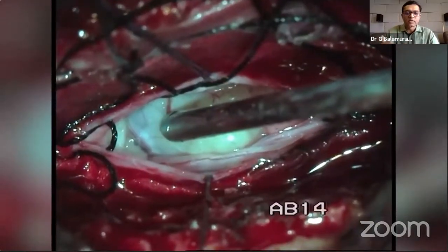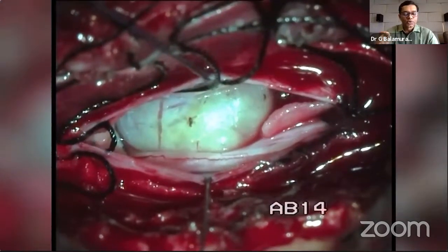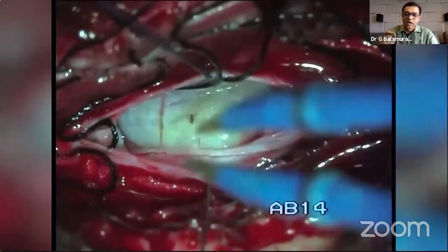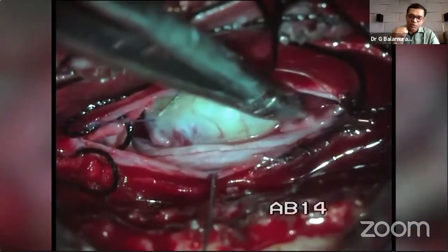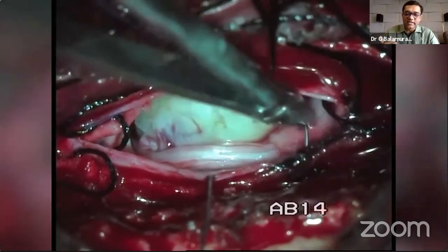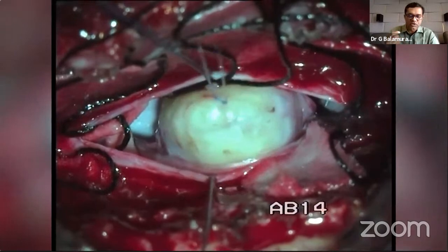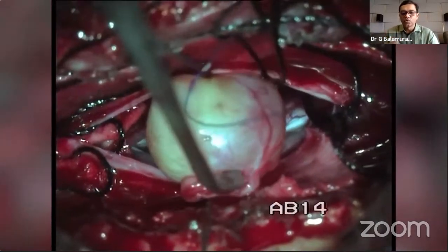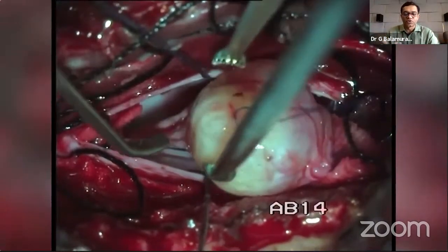A similar tumor, a schwannoma, was quite a large lesion causing significant neural deficits in this young patient. You go in and slowly shrink the tumor. Then you pass a needle; you can use different techniques. I was not able to deliver it very easily, and I was putting a lot of pressure on the nerves, so I just put a small stitch on it, gradually pulled it up, and it comes out. Then you see the rootlets. You cannot separate the rootlets in this case; the schwannoma has completely engulfed them.